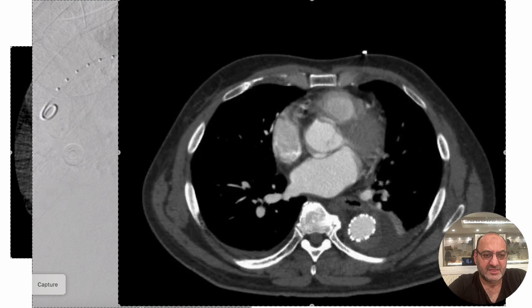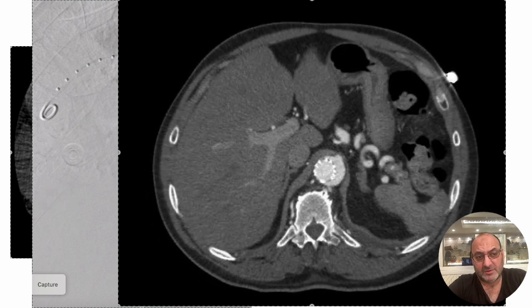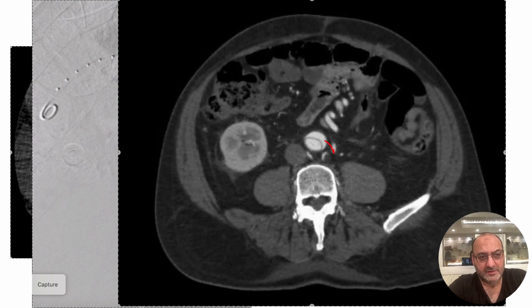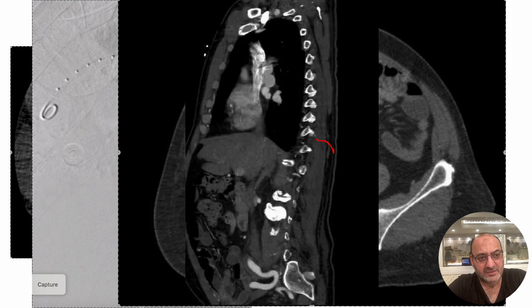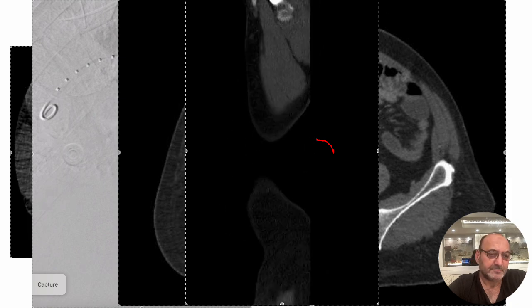We used a dissection stent here, but we did not do the stabilized technique. We did not balloon this one. But still, if you look at the false lumen here, it's still there. We'll see what happens, but the true lumen is pretty open, it's pretty good results. And look at the sagittal views, and that's just 2 days after the procedure.